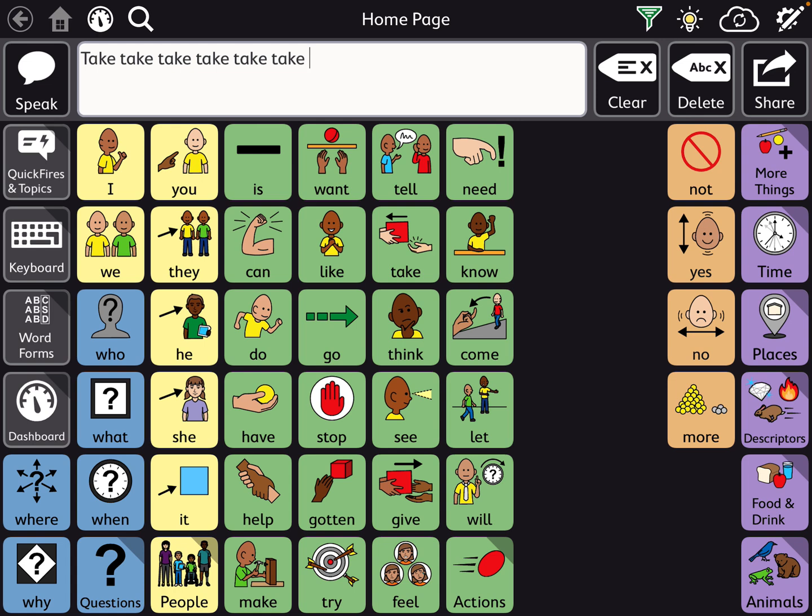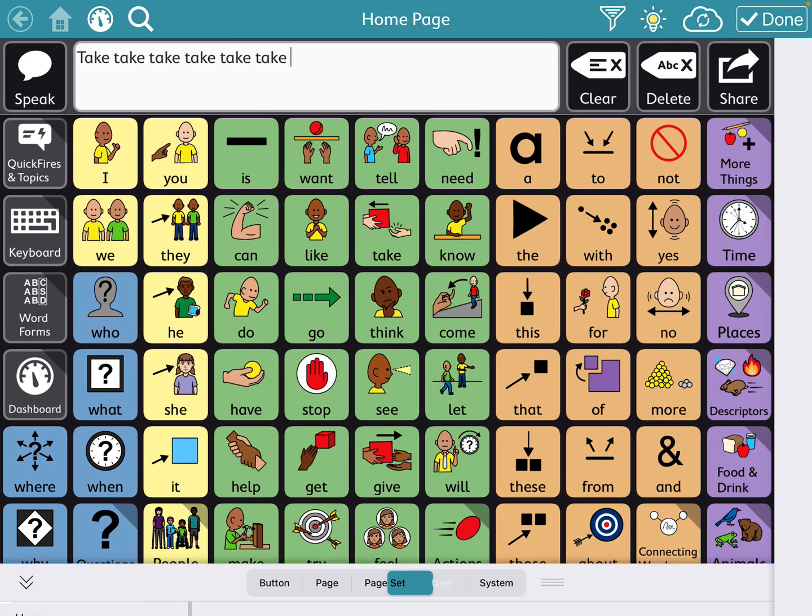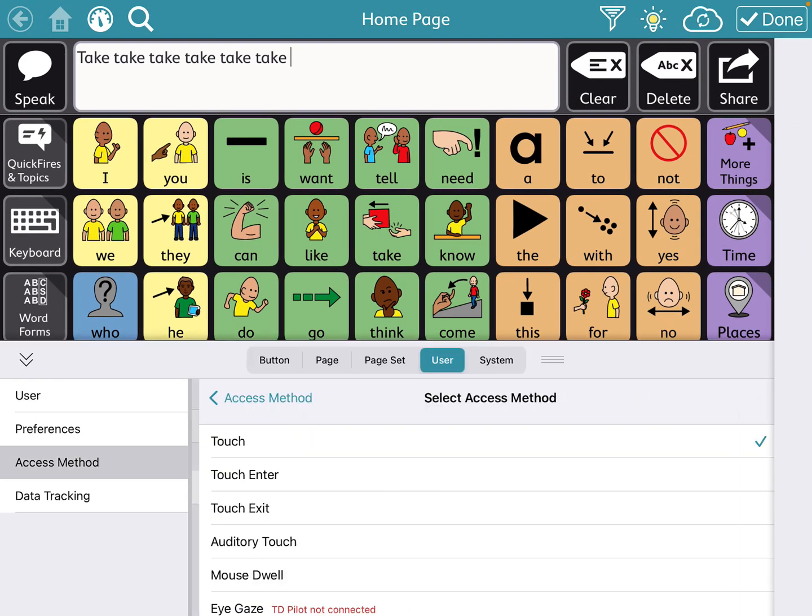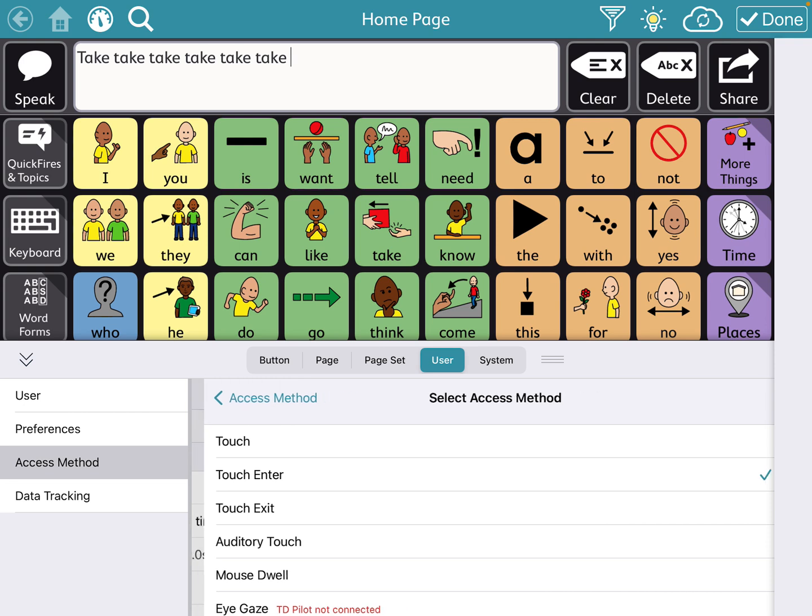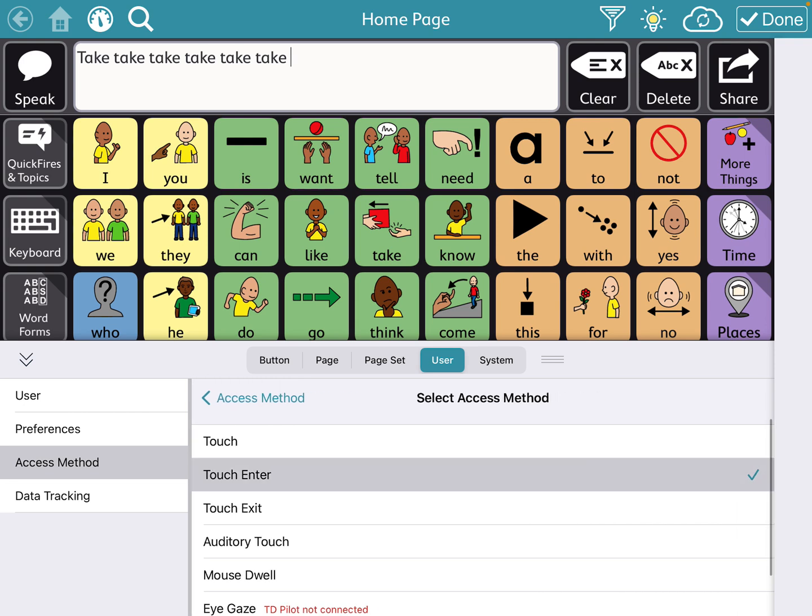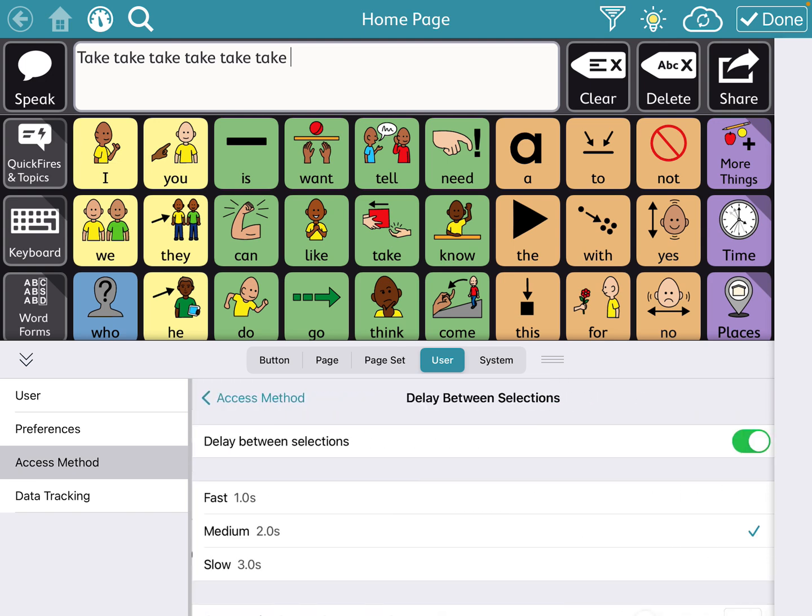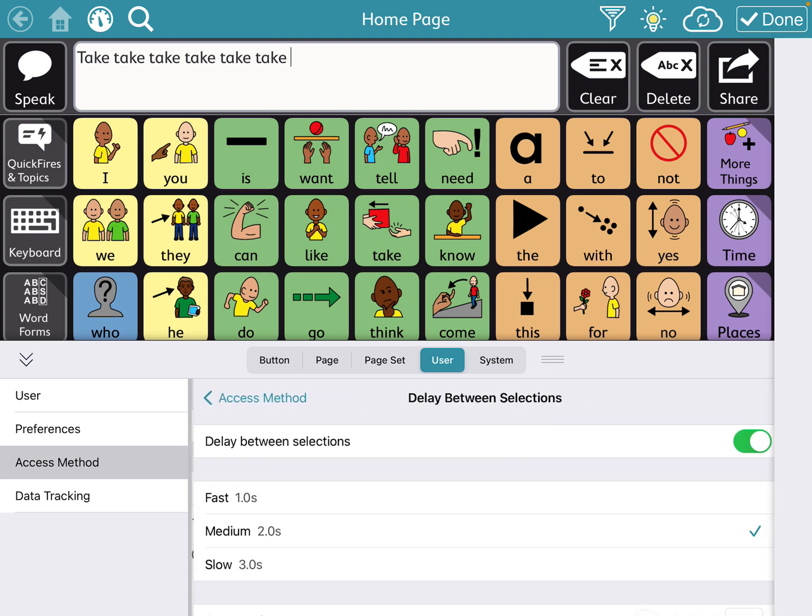Go to that top right hand corner here, go to user and now access method. And this will be where you do touch enter. And now there's going to be a delay. You want to go delay between selections. And so you can do medium, slow.